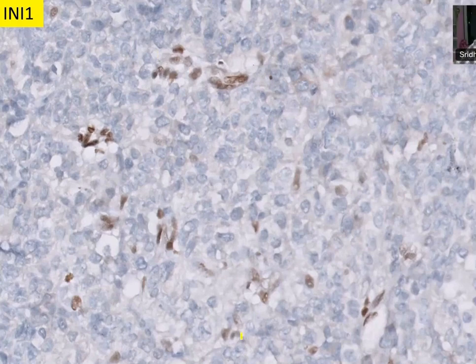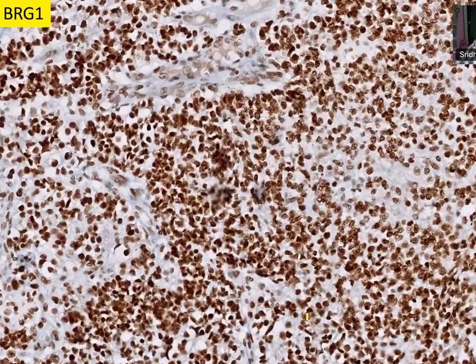So this is the higher power picture of INI1. This is another IHC utility marker of INI1 protein, where loss of expression is a marker of loss of functional alteration of the INI1 gene. You also have another protein, which is BRG1. A small subset of ATRTs can show BRG1 loss also. So BRG1 and INI1 are good immunohistochemistry markers for atypical teratoid rhabdoid tumors.